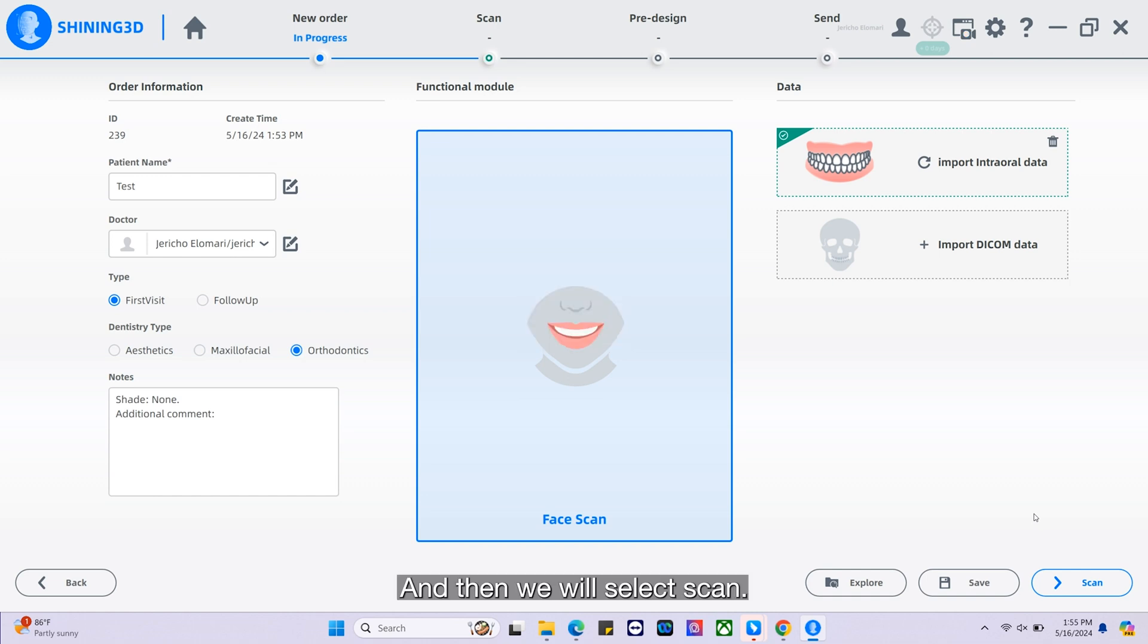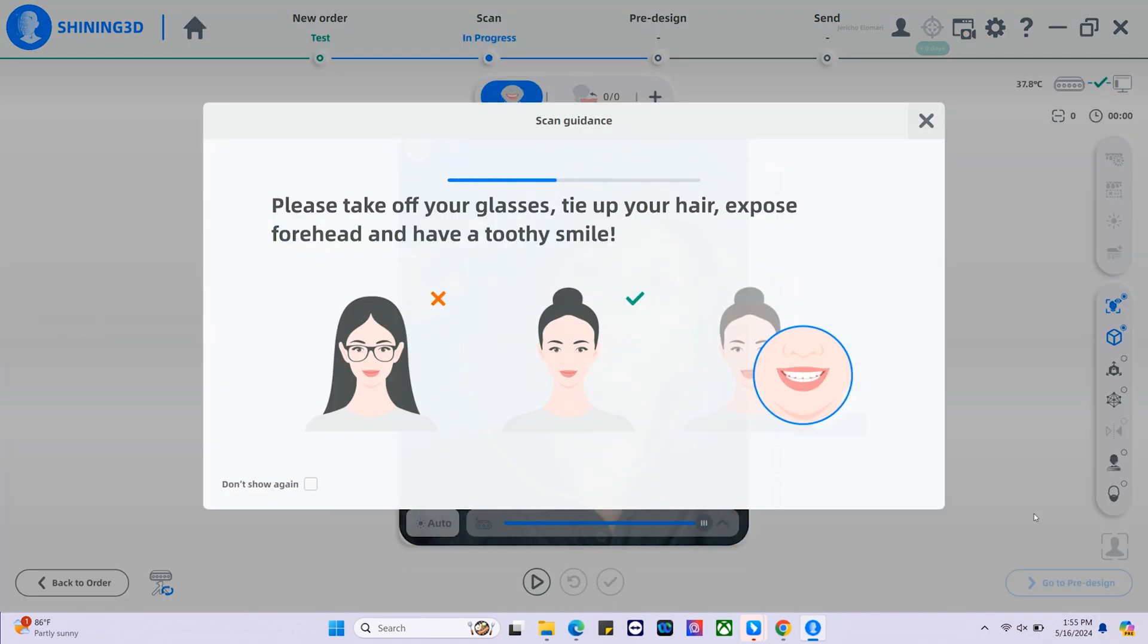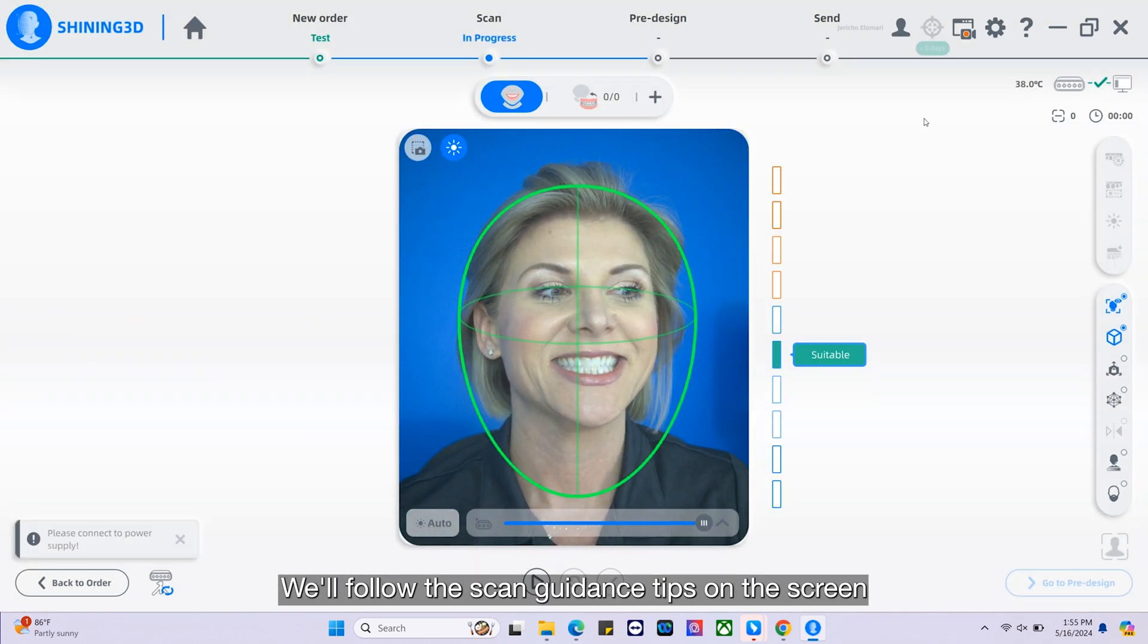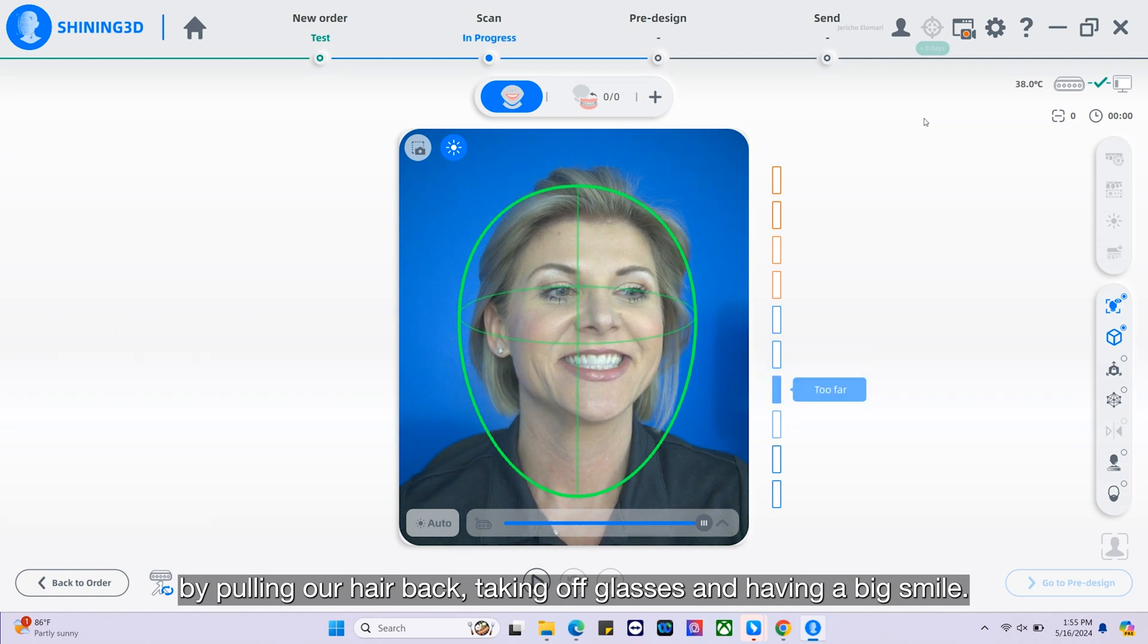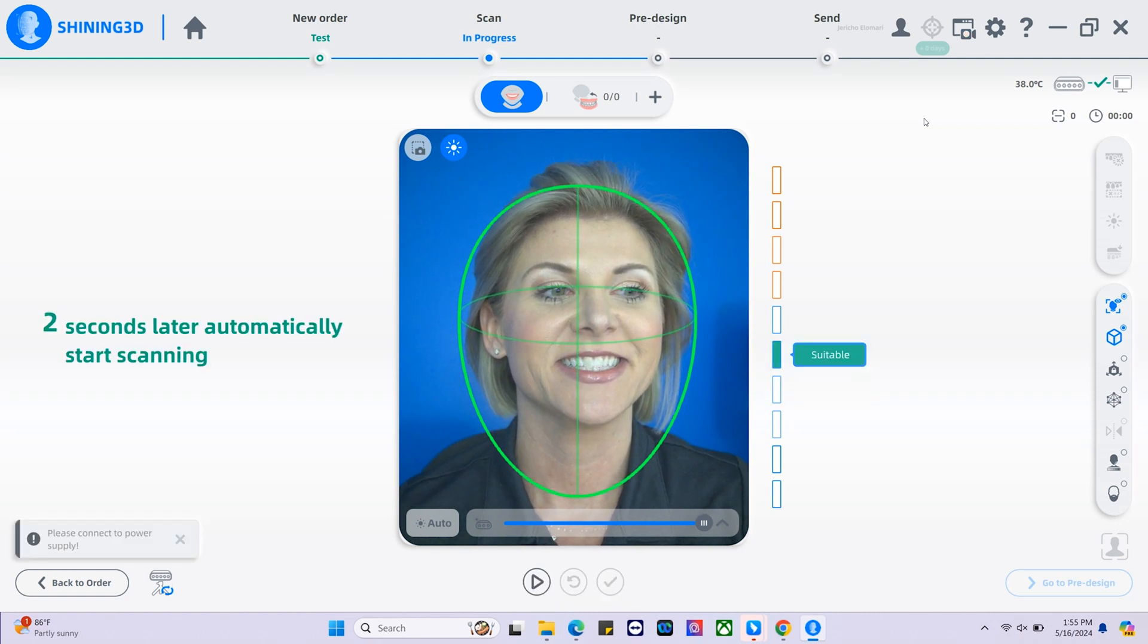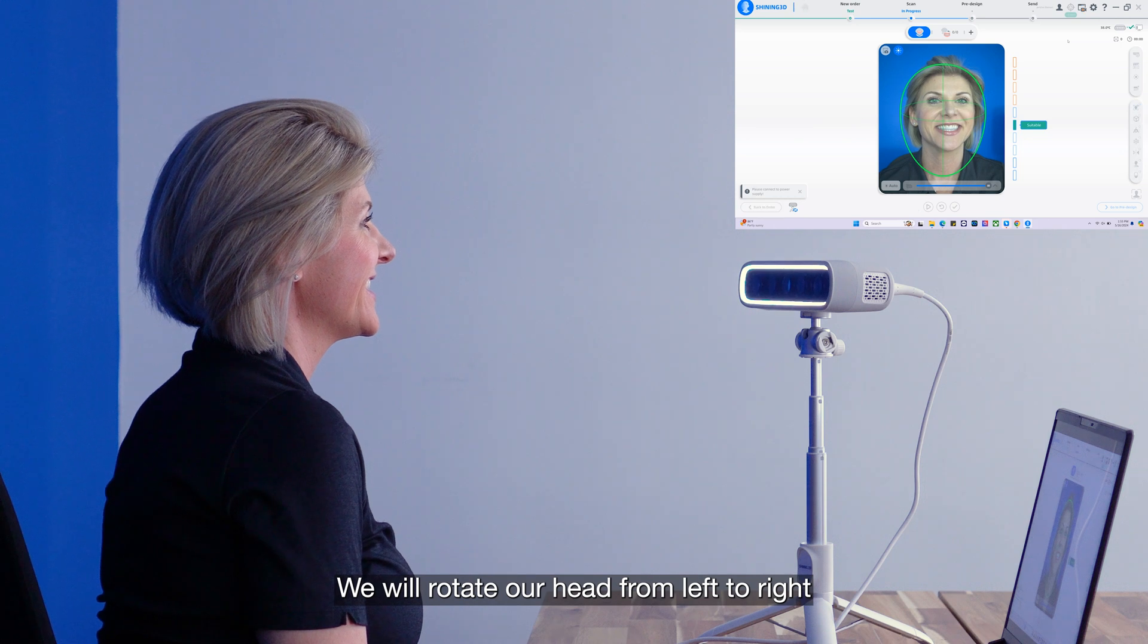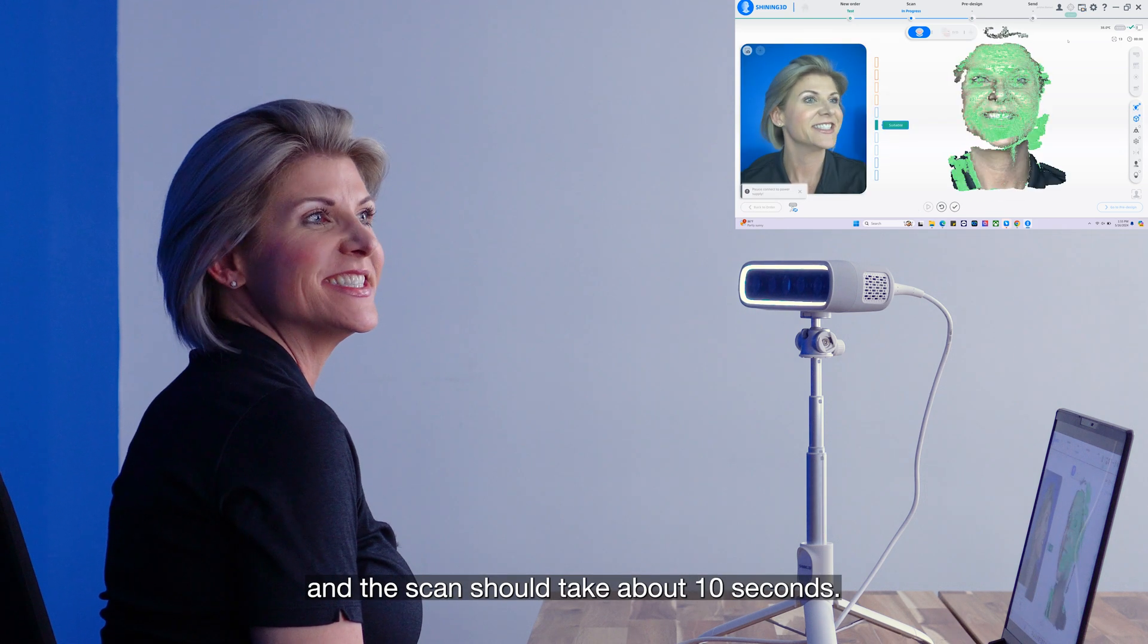And then we will select scan. We will follow the scan guidance tips on the screen by pulling our hair back, taking off glasses, and having a big smile. We will rotate our head from left to right. The scan should take about 10 seconds.